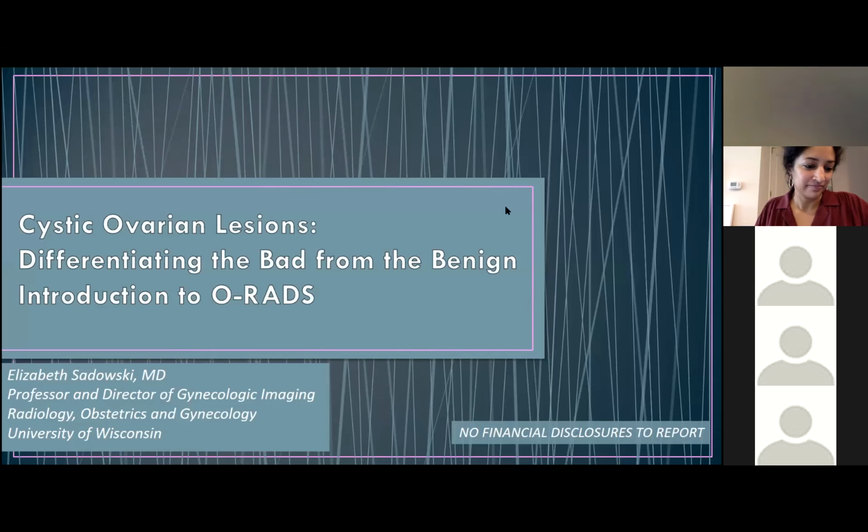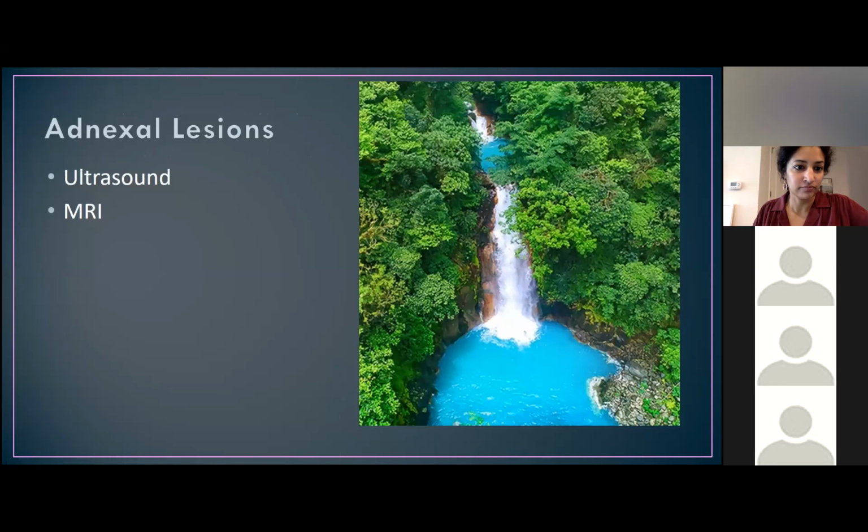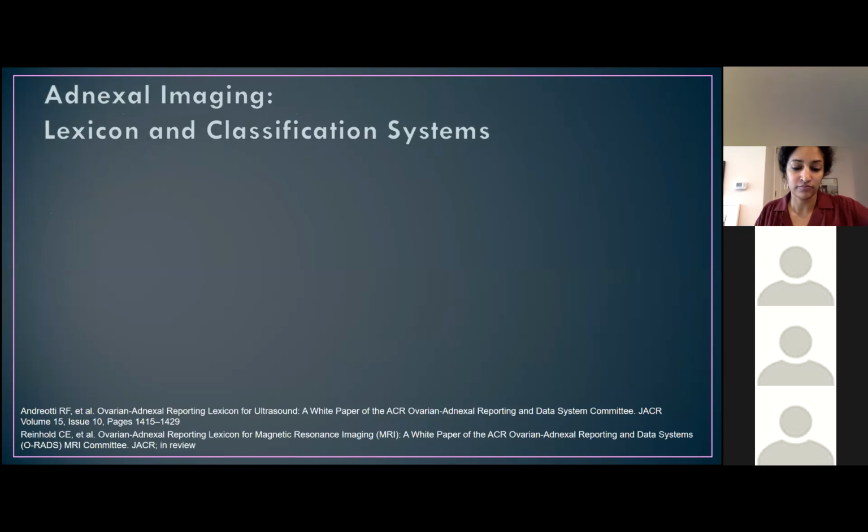I'm going to talk for a few minutes on the cystic ovarian lesions, differentiating things that look bad and things that don't look so bad. And I'm going to talk about ultrasound and MR really quick, because these both kind of go together when it comes to looking at ovarian lesions.